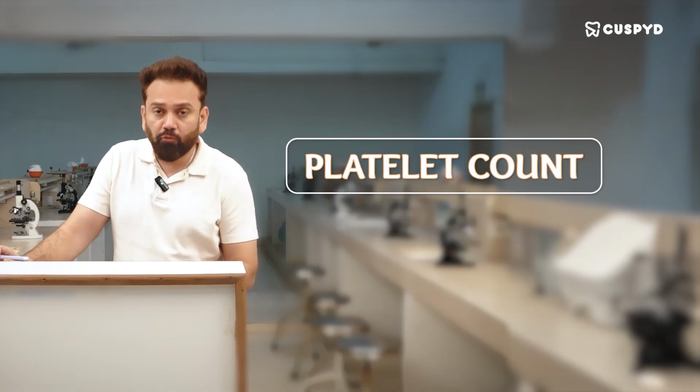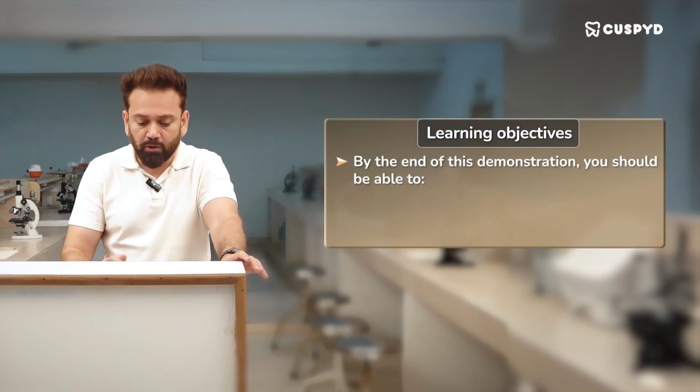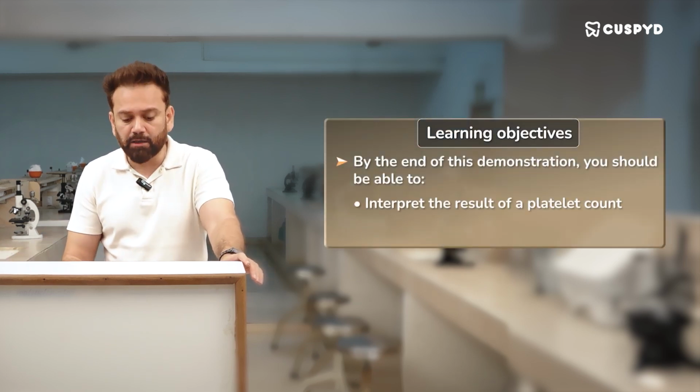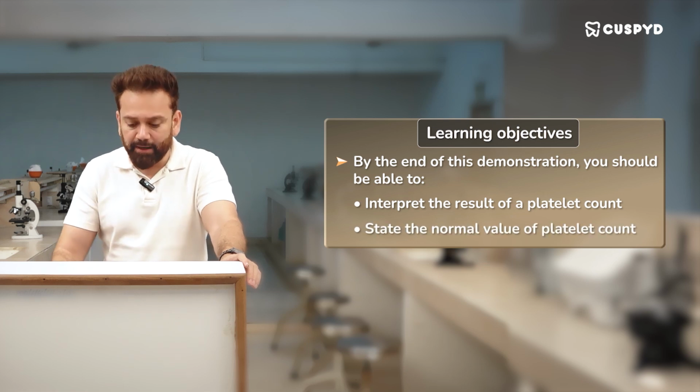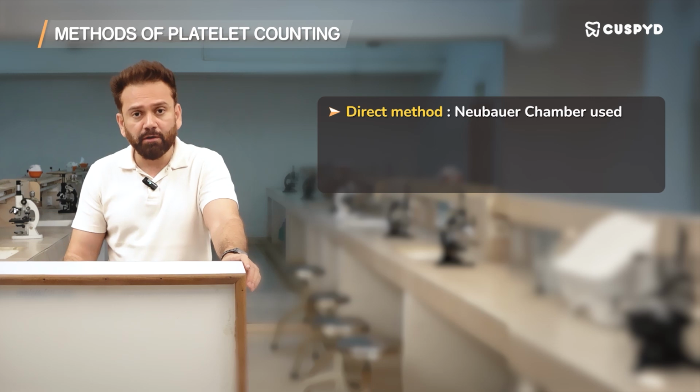Now we will be discussing the platelet count. So what will be our learning objective? At the end of the demonstration, you should be able to interpret the result of platelet count and state the normal value of platelets. So the method, again, we will use the Neubauer chamber, of course the improved one.